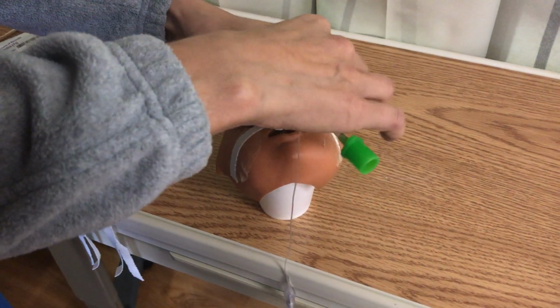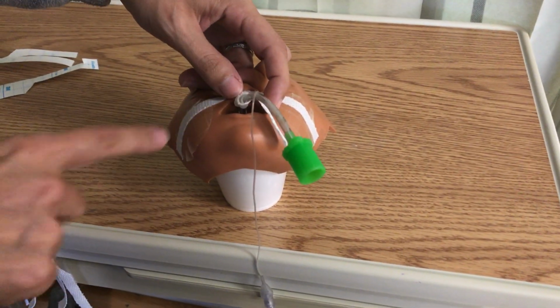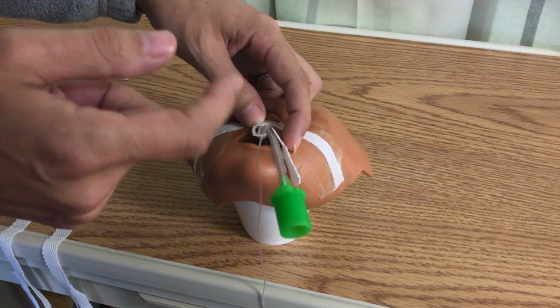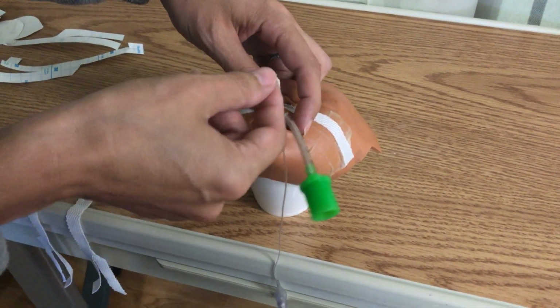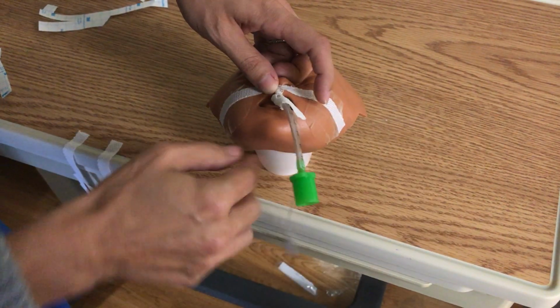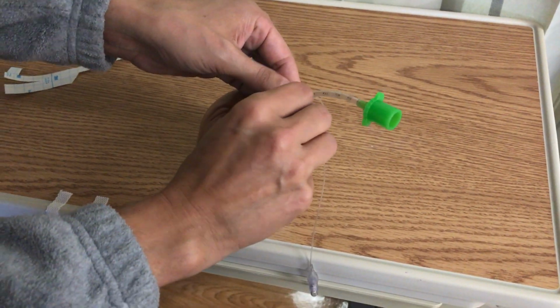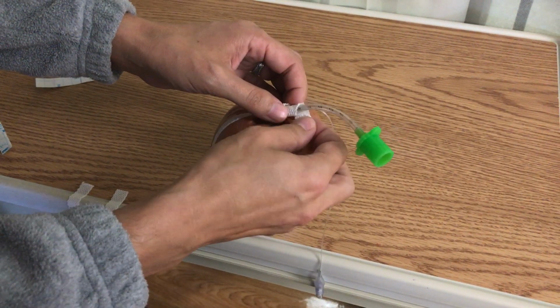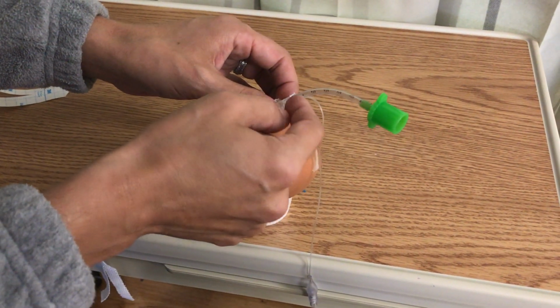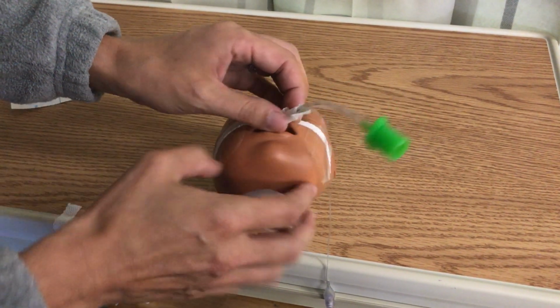Then as I'm wrapping this around, if I don't pull tightly enough and I leave gaps between the tape and the tube, that's an area where drool or moisture can get into that gap and begin to dissolve the adhesive and make the tube less secure. So if I do this too loosely and I don't pull the tape as I'm going around, I'm decreasing tube security. Also, if you put too big of a courtesy tab on the end, again, that's part of your tape job that is not actually sticking tape to tube. And when we go over this with our next piece, this part of your tube is not secure.